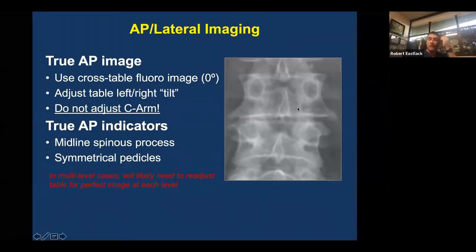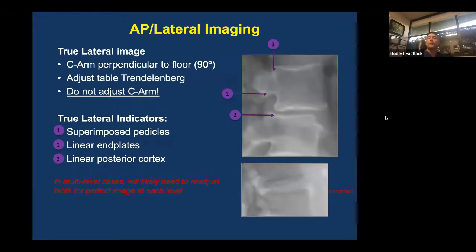If you want to get a pure AP and a pure lateral view — the AP being the bisected interpedicular distance with the spinous process and on-face view of the end plates — if you want to move the table to find this view, you do not want the C-arm and fluorotech adjusting their platform. The rationale is you want them in a very simple 90-degree transition from one view to the other, without having to reinvent cant, tilt, and oblique every time. Move and arrange the table — tilt it, Trendelenburg it, however you need to — to get these perfect views with the C-arm initially in the AP view, and then a lateral view with a perfect view of the pedicle superimposed and on-face view of the end plates.